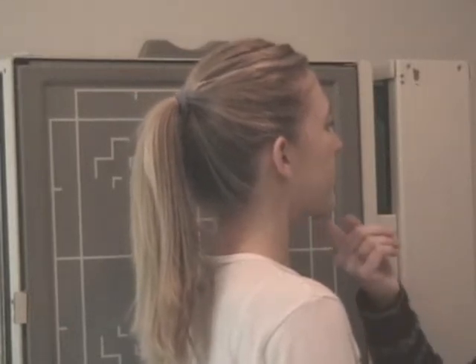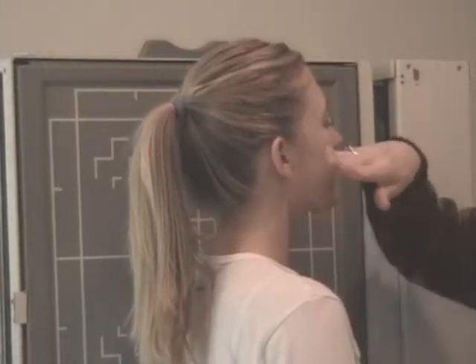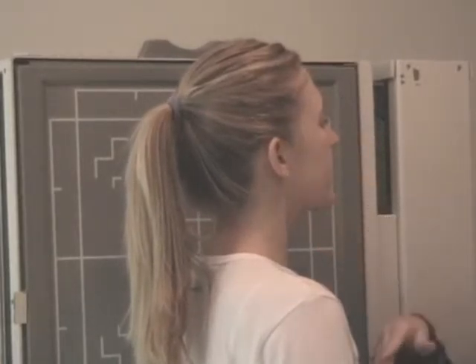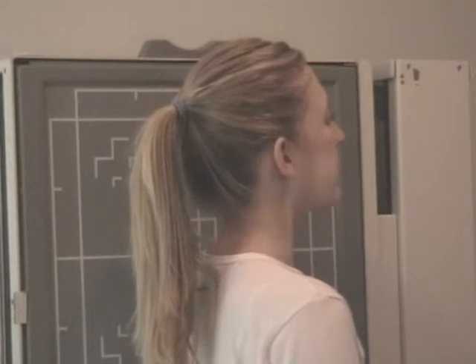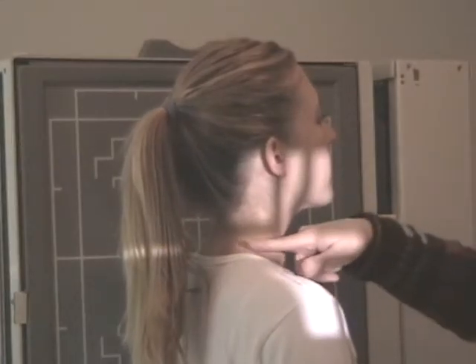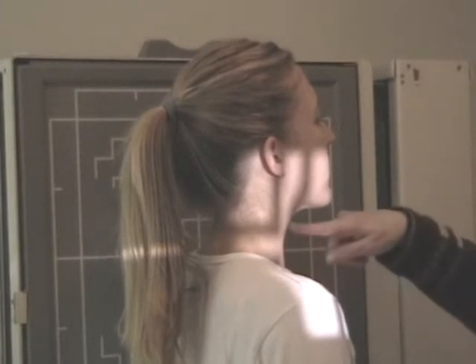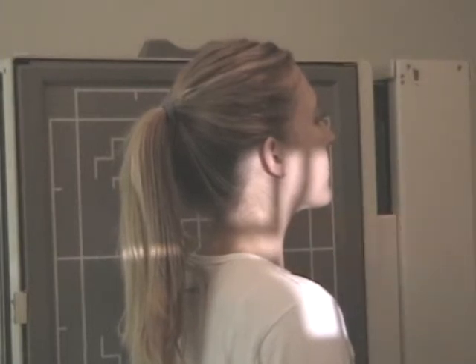Okay, so elevate the chin. So they're just like the infraorbital meatal line is parallel, the chin is parallel to the floor. And I want this crosshair coming in right at the level of C4, which is just above the Adam's apple, just above the bump. So I need to elevate my tube a little bit and my film.